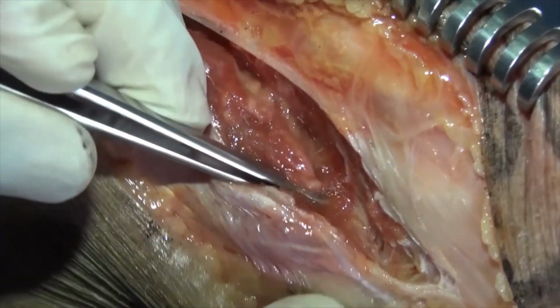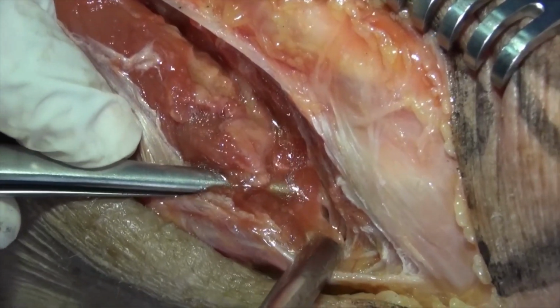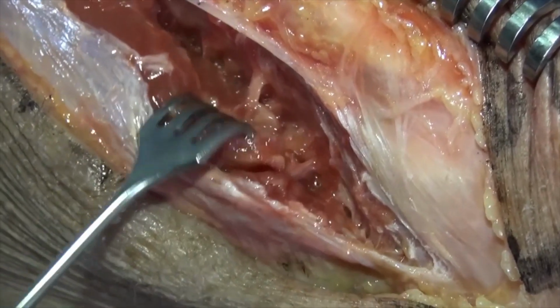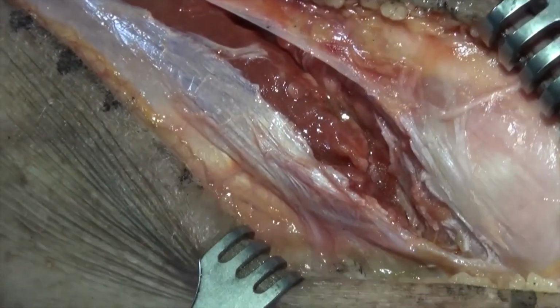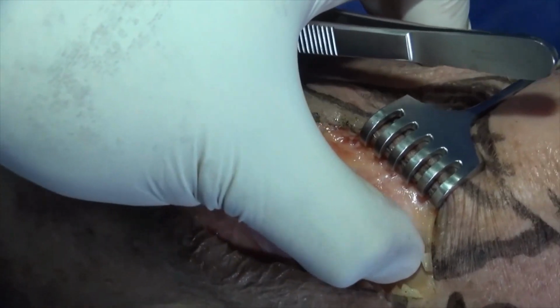So now I have reached the anterior limit of the fibula, which is fibula head, which is over here. And the next step is identifying where the joint is. So I have marked the joint, but in real life what I do is I use a needle. So we don't have a needle here at the moment.